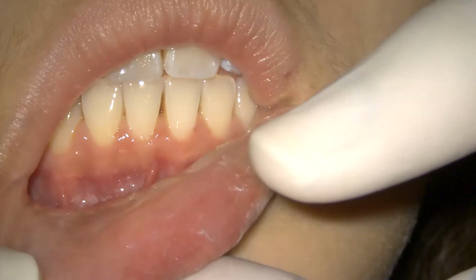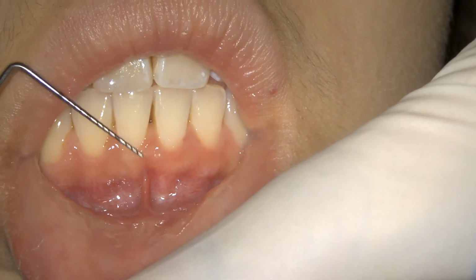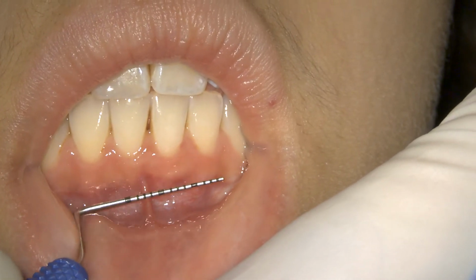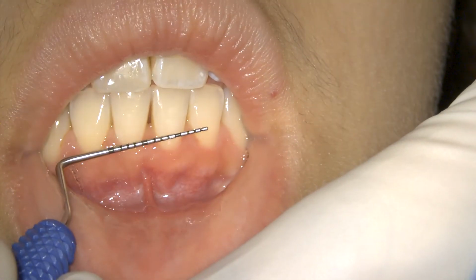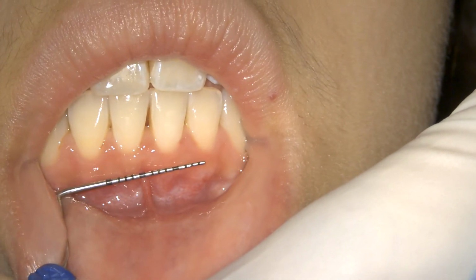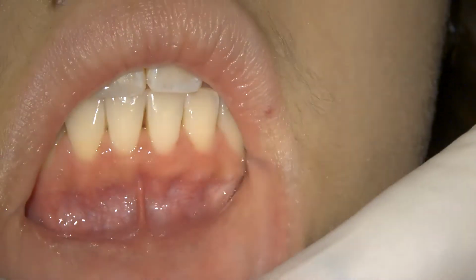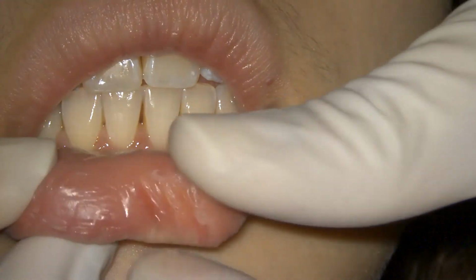Do you really observe any movement of the papilla or the marginal gingiva? No, not really, right? Because there is an adequate amount of attached gingiva. The attached gingiva is very tenacious, adhered to the periosteum, and therefore the movement can be resisted. Therefore, the movement is not transferred to the marginal gingiva or the papilla. In other cases, if you see there is inadequate attached gingiva, then whenever you do this tension test, you can observe movement of the papilla and the marginal gingiva.